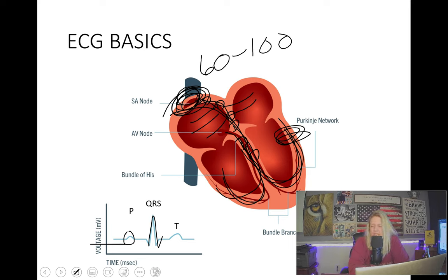So it's kind of flat, but it's still upright. So I have a P wave, P wave, P wave. They're kind of flat, but it doesn't matter. It's not of clinical significance to the nurse, and certainly not of significance on the NCLEX, okay? What you need to say is, is it upright? And you go, well, it's a little flat, but it's still upright. And if it's upright, that means what? It means it's a sinus rhythm.